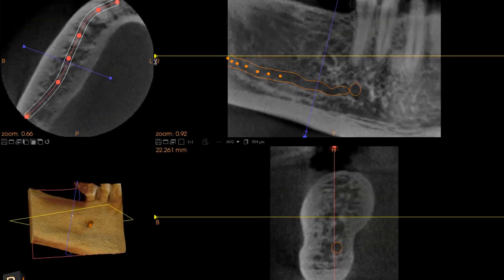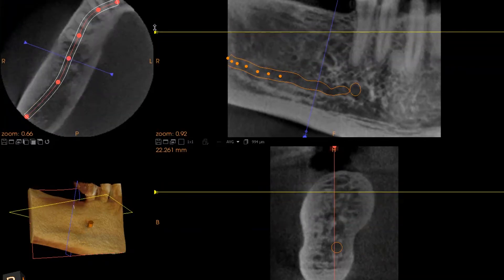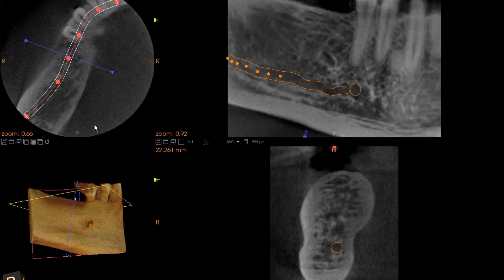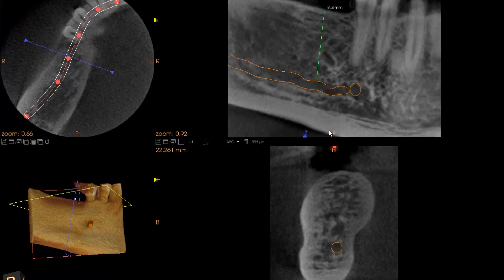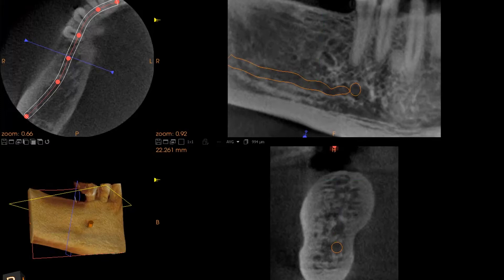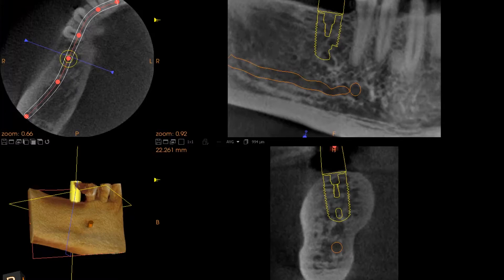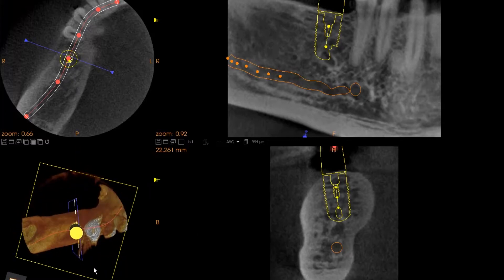This is a focused field cone beam CT from the Kodak 9000 3D. We're looking at the lower right. I've mapped out the mandibular canal and mental foramen, so now we can measure the bone dimensions. You can appreciate this man has a tremendous amount of bone volume — 17 millimeters from the bone crest to the nerve, and 12 millimeters of ridge width. After measuring your dimensions, you can place a digital implant and see how it fits within the available bone.